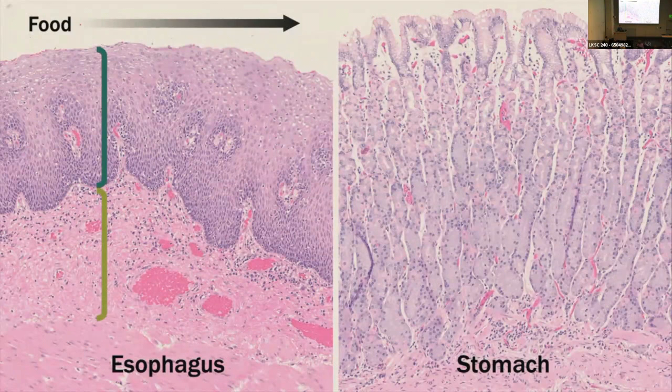And you can see how it looks slightly different from the collagen layer that's above. Smooth muscle cells are very elongate. They're kind of shaped like baguettes. And so the nuclei are also very elongate. And the pink stuff in this layer is intracellular instead of extracellular, and it's actin and myosin. So this is how you can break down one tissue, and then I'm just going to zoom through the rest.